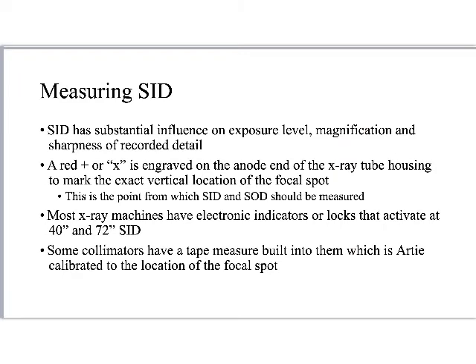So, measuring SID. SID has a substantial effect on exposure level, magnification, and sharpness of recorded detail. Basically, as SID increases, we would expect to see the exposure intensity drop off. Magnification would also drop off, but sharpness of recorded detail would increase.